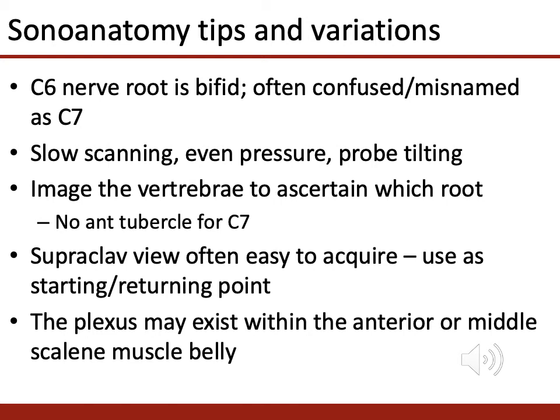Other sonoanatomical variations: we often see the plexus sandwiched between the scalenus muscles. However, the plexus may exist within the belly of either of those muscles, so within the belly of either the anterior or middle scalenus muscle. So it's important to appreciate that that anatomical variation exists.